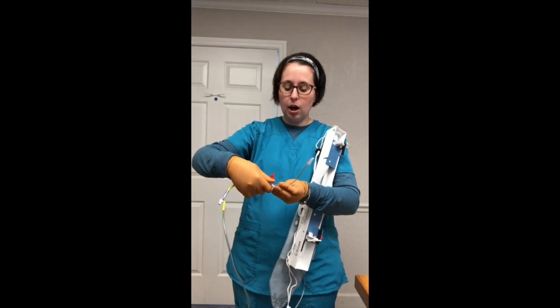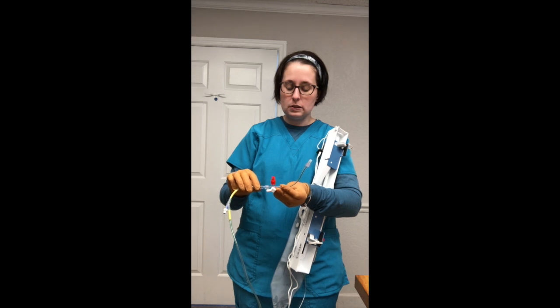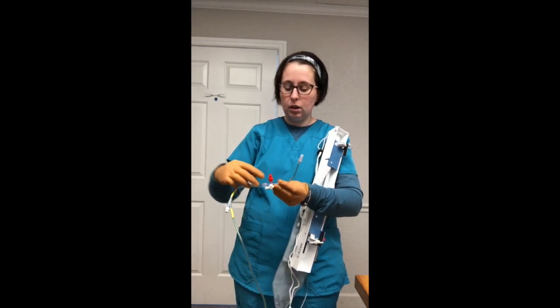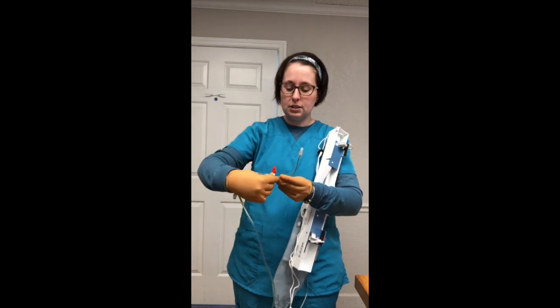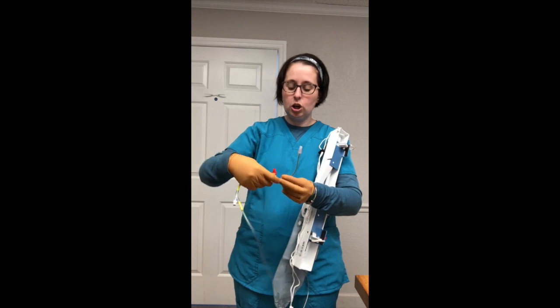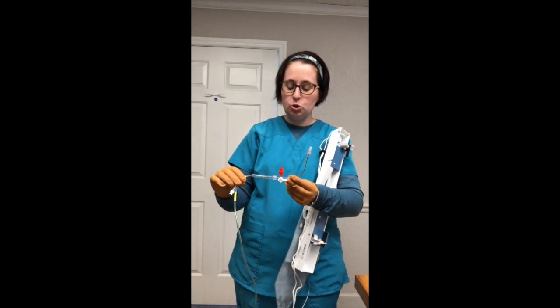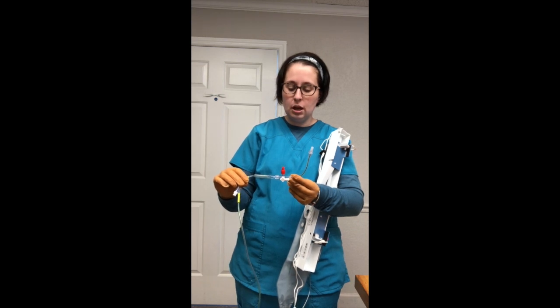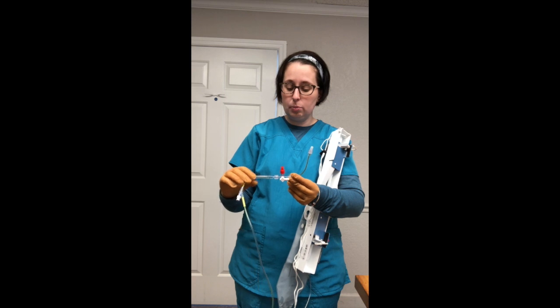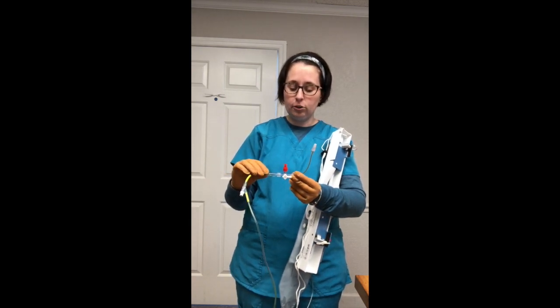You would turn the stopcock off to the system, attach your sterile syringe, and slowly aspirate 2 cc's of CSF off the patient. Then you would turn this off to the site, attach your saline syringe here, turn it off to the patient, and you would flush away from the patient. You should never flush towards the patient. If all of these measures do not help the drain to become patent, you would contact the neurosurgeon for further instructions.